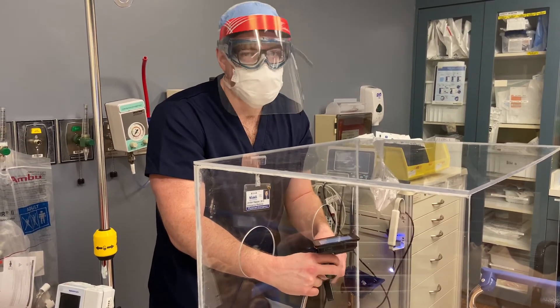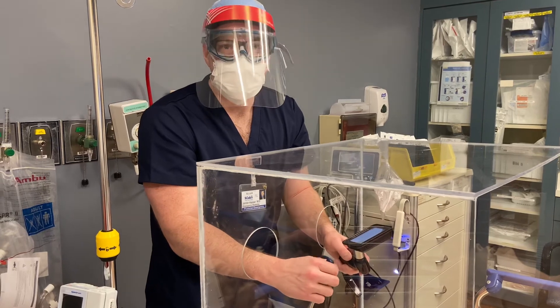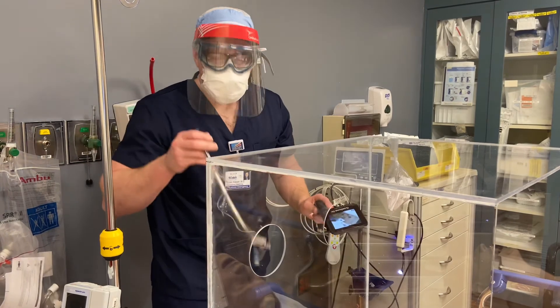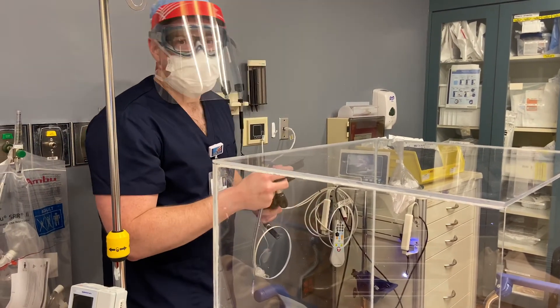If you're really a DL person — which a lot of people are — that's okay, and it's clearly an important skill. But give it a shot. I know some of you docs can intubate direct in 10 seconds, so it's up to you. Give it a shot or stick to DL.